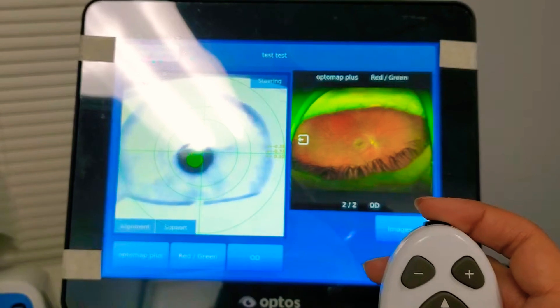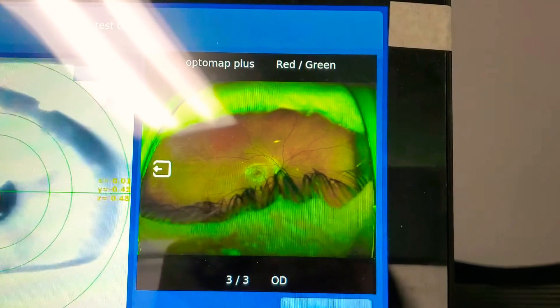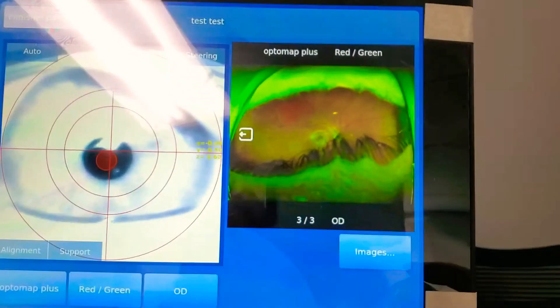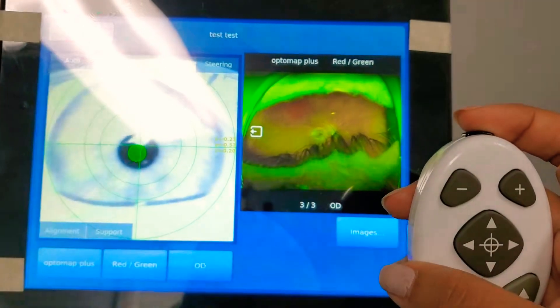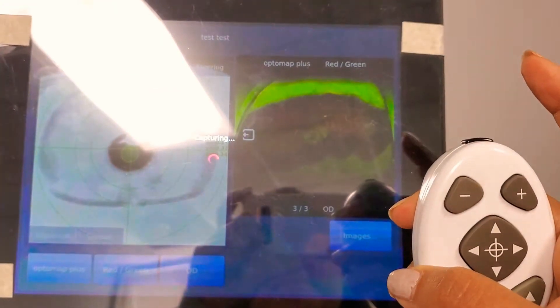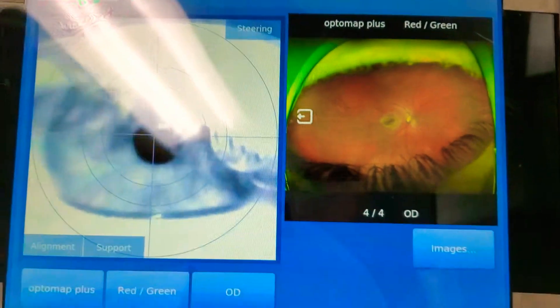All right. One, two, three. This is without dilation. So the patient keeps blinking. We're going to try one more time. Zoom out a little. Open wide. One, two, three. Looks like that's as good as we're getting for today.